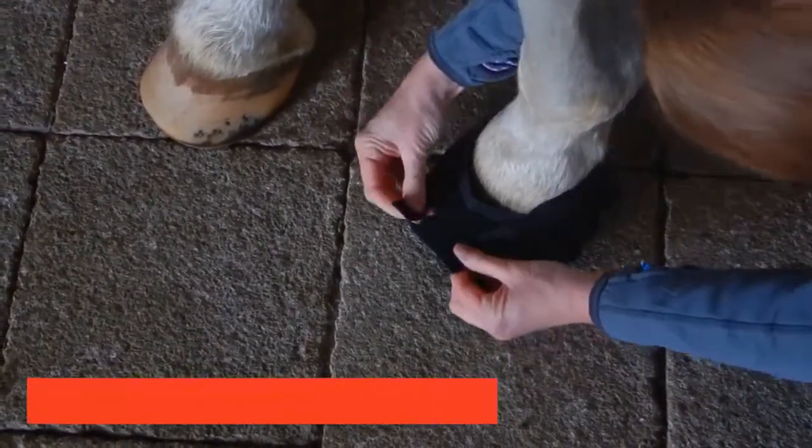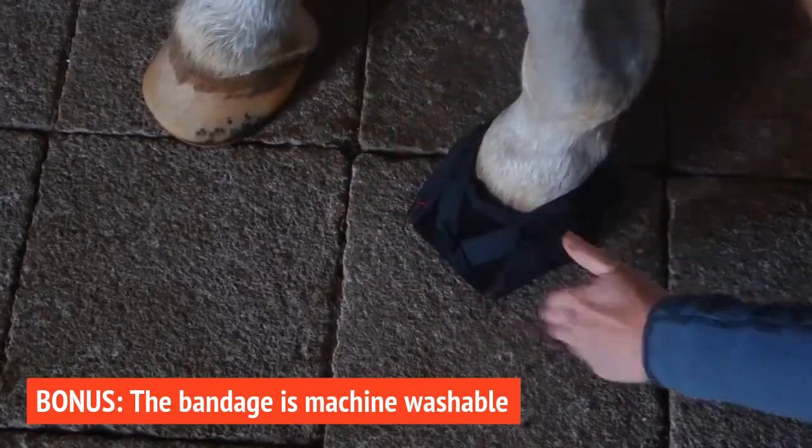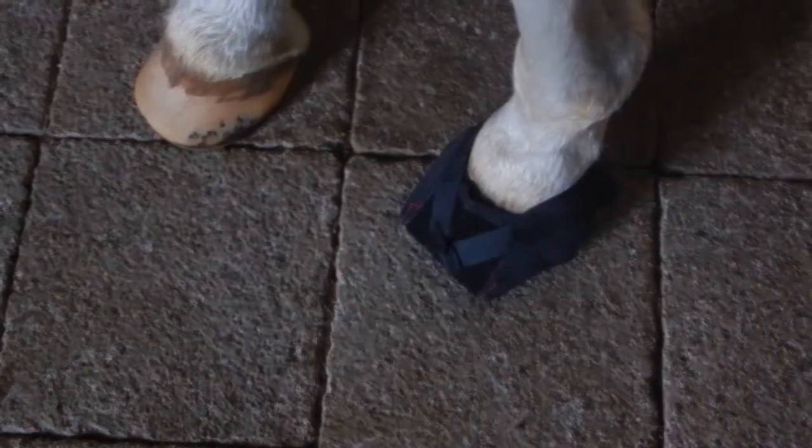The bandages are machine washable and durable enough to use as a backup hoof protection when your horse has lost a shoe.